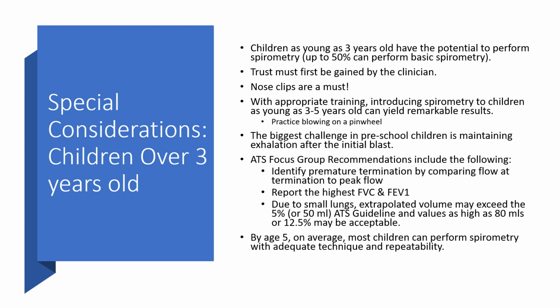The American Thoracic Society, or ATS, focus group recommendations include the following. Identify premature termination of the exhalation by comparing flow at termination to peak flow. Report the highest forced vital capacity and FEV1.